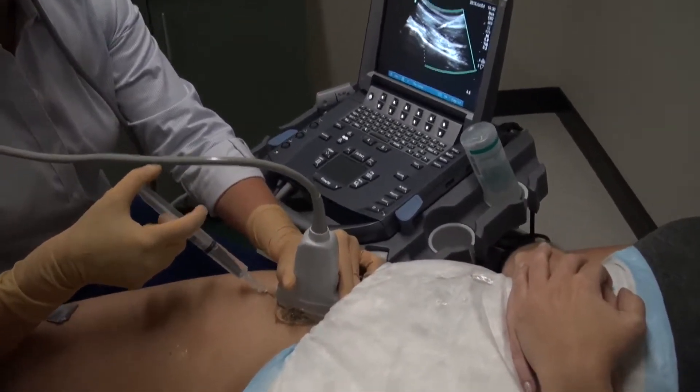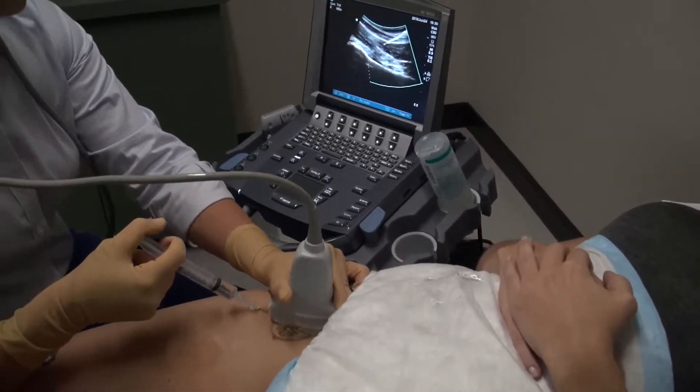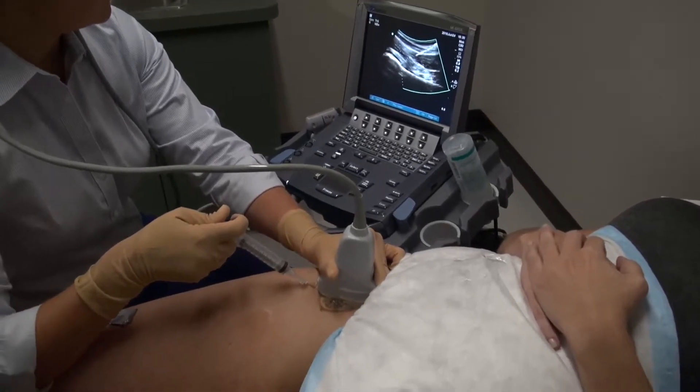Once the capsule is pierced, the medication can be injected and visualized entering the capsule. Once complete, the needle is removed.